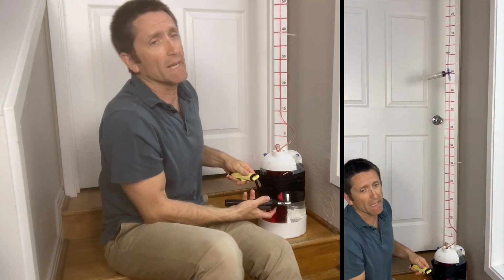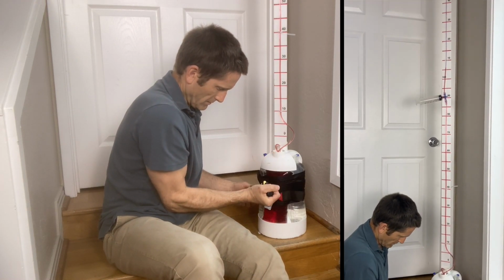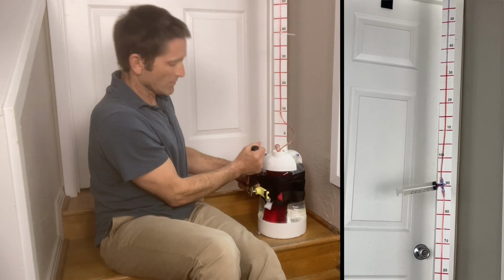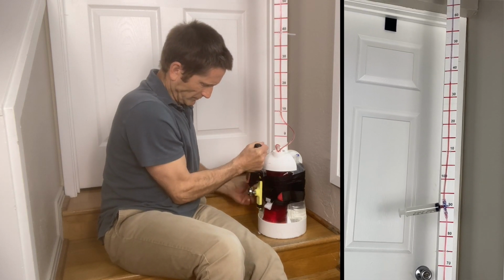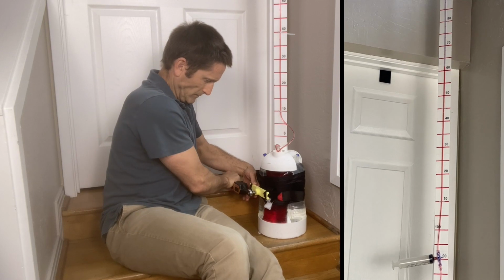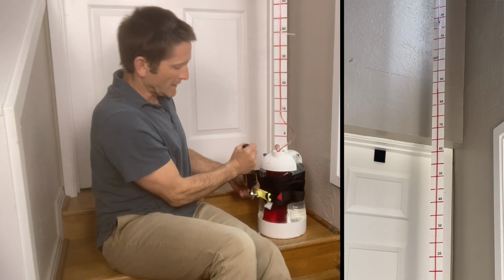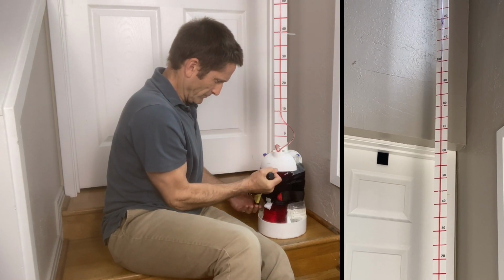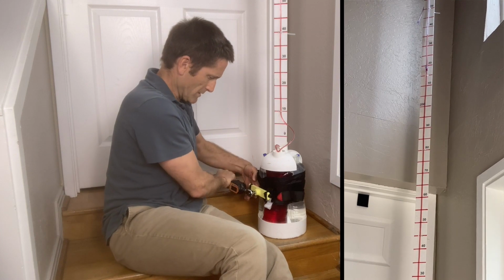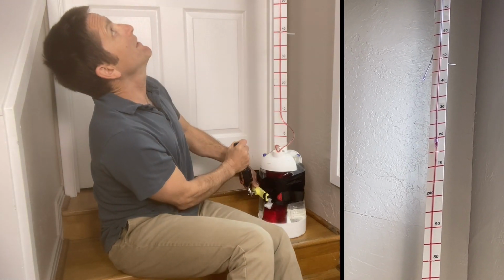All right, so let's say our starting pressure, 85. All right, so torque 1.31, and I'm up to 135. 2.77. 160. 3.45. 185. 3.45. 235. 3.45. 255.